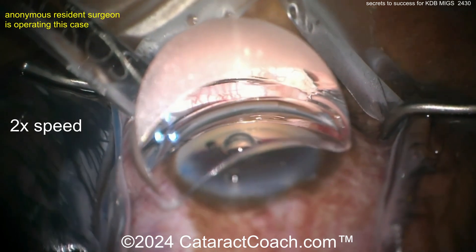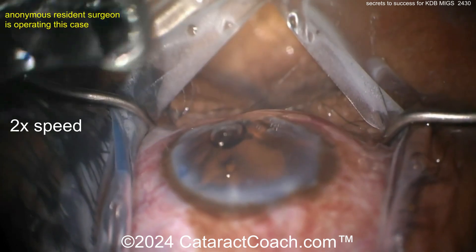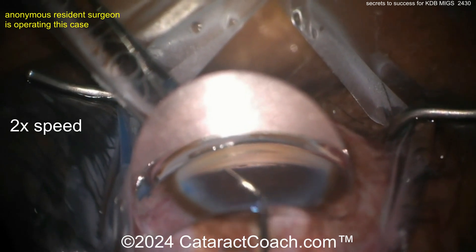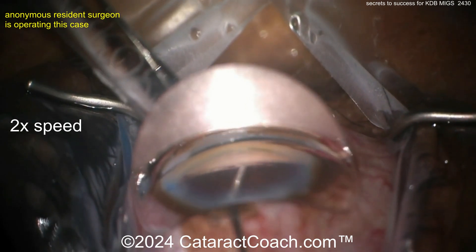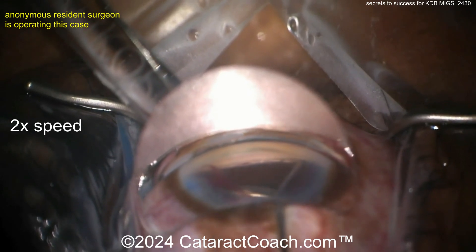This is a procedure that every cataract surgeon should be able to do — it's not that difficult and you can certainly learn it yourself. It's a great MIGS procedure — minimally invasive glaucoma surgery. More viscoelastic to really open up and strip the trabecular meshwork and open up that canal. Nicely injected.